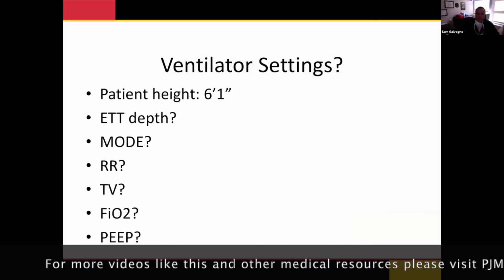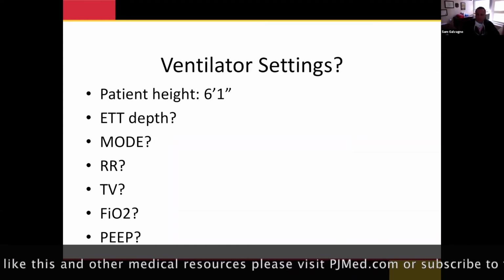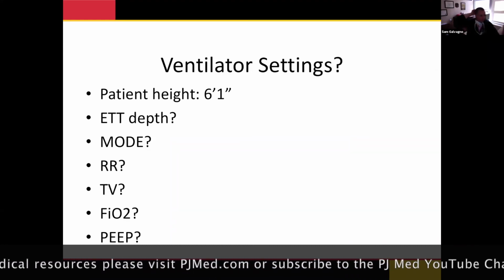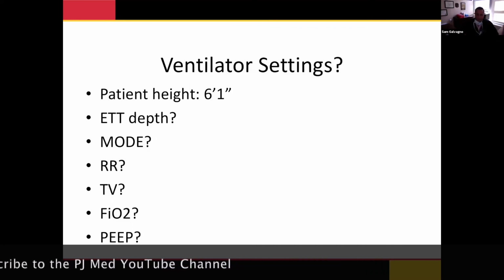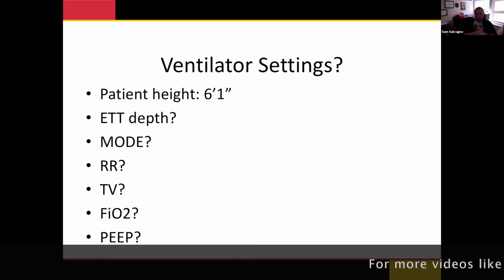This patient's 6'1". So real quickly, just give me a tidal volume, and then I just want to move through this one more time. I want you to get used to doing this, thinking about what you need to answer for these patients. So if you're putting this patient on the ventilator, you intubate.